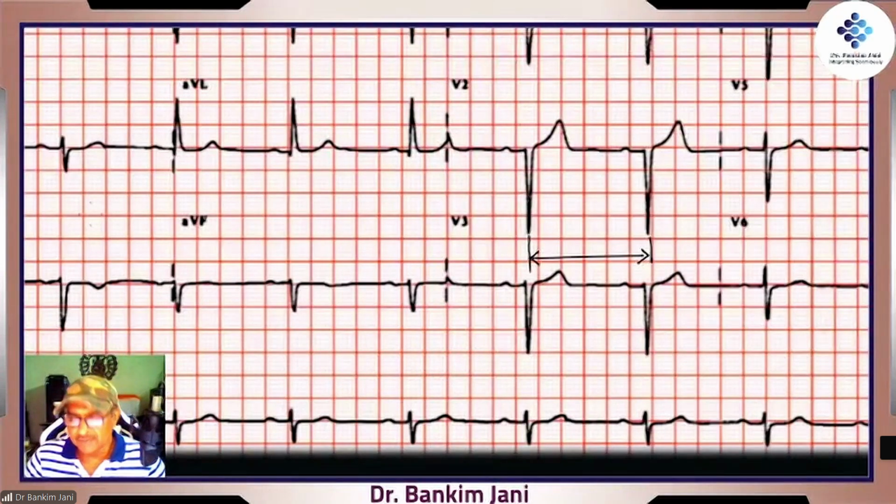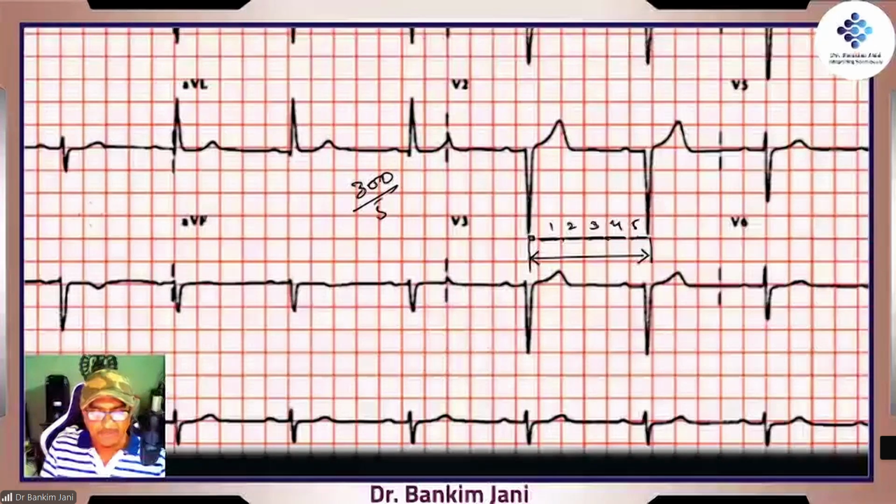हाँ, 56 चलेगा. 56 is okay. I mean when you are calculating small squares, that's fine. Great. See, one big square, second, third, fourth, fifth big square, right? To be accurate, we have to calculate this one extra square also. But let's say roughly we want to do it. So 1, 2, 3, 4 and 5. 300 divided by 5.